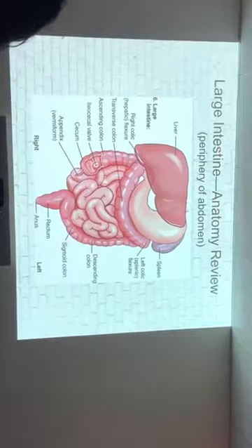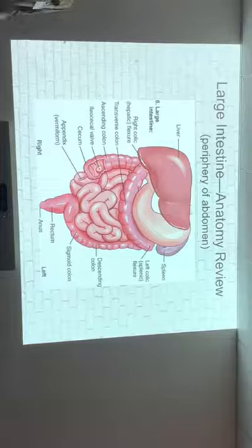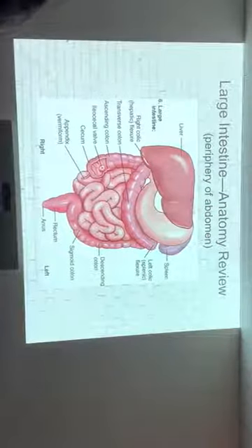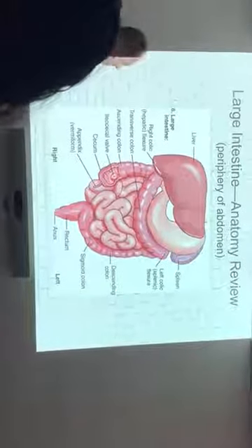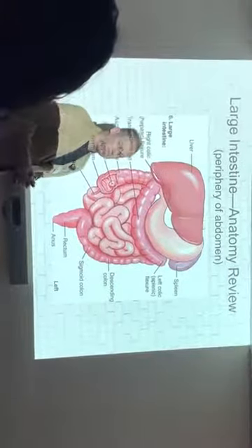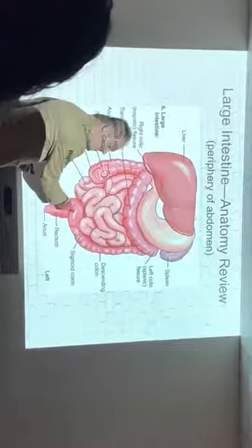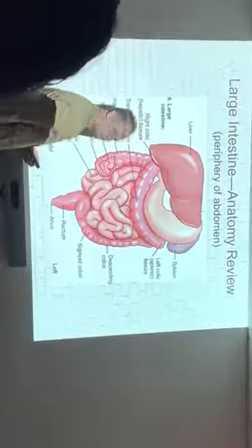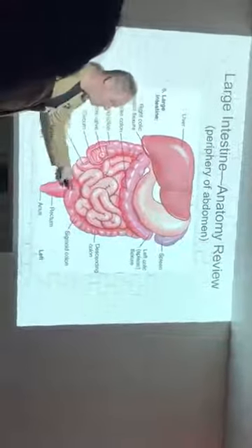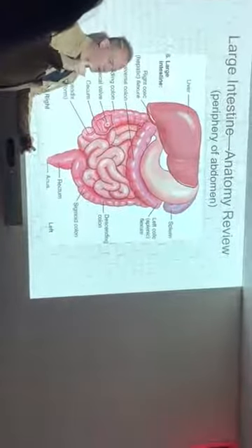So where does that one stop? Where does what stop? When you put it through your anus, where does the tip stop? Well, some people push it way too far, but generally about right here, close to the sigmoid. You don't want to push further because you can actually rupture the wall of the large intestine if you get too aggressive with it. How do you know? Does it stop by itself? There's a little line on there that shows you where you shouldn't go past.